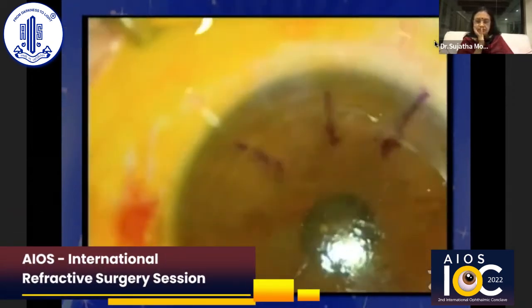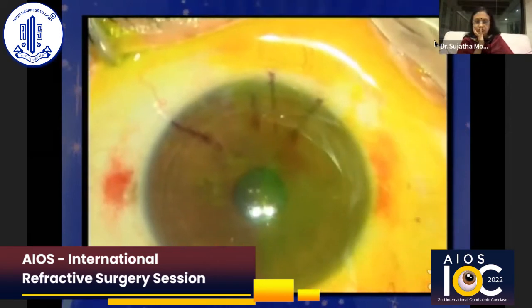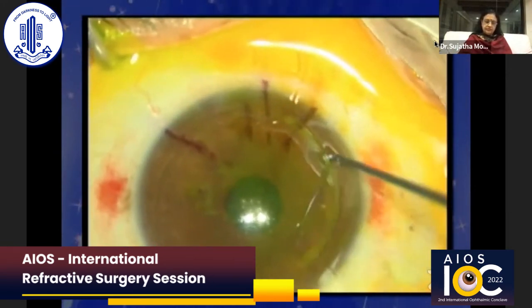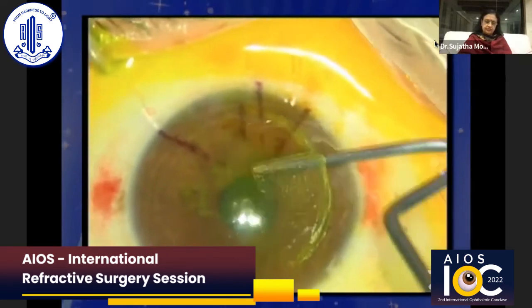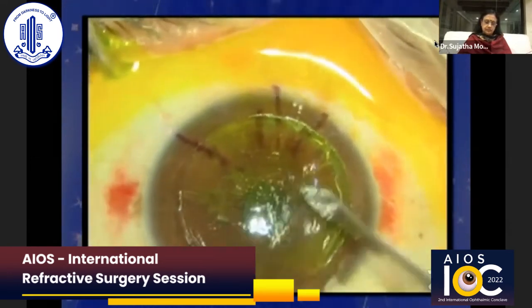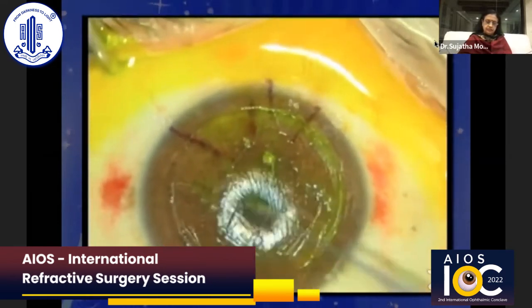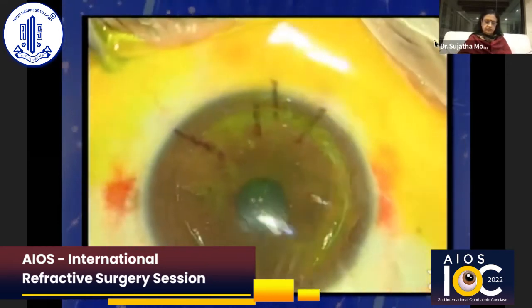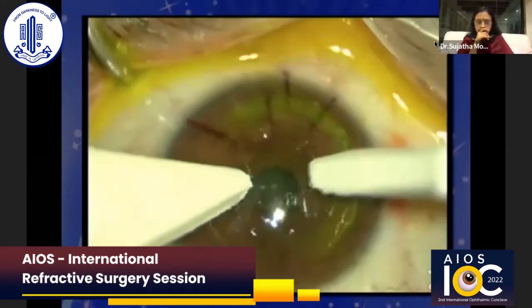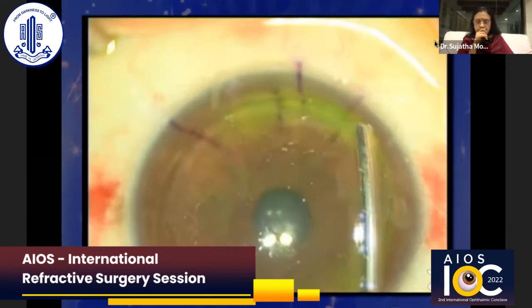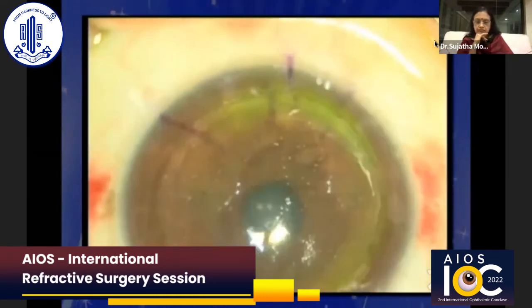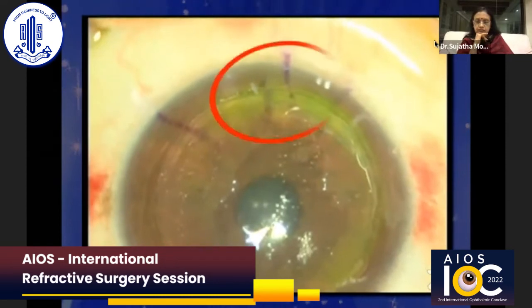Femto flaps show less incidence of flap displacement and striae due to better fitting of the flap on the bed. However, this femto flap shows radiating flap striae originating from the hinge. The epithelium of the striae is removed after lifting the flap, the striae are stretched perpendicularly, and the flap is replaced on the bed after thorough washing of the interface. The pre-placed marks show a significant shift after realignment of the flap.